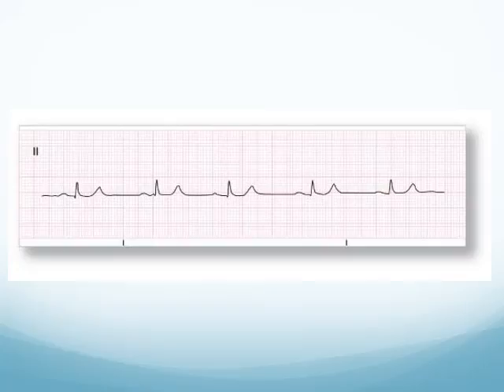What is our rate? It would appear that our rate is about 50 beats a minute. And I'll tell you what I'm doing here. Hopefully we'll have some paper handouts for you by the time you're listening to this. What I'm doing is holding a piece of paper up to the screen with two lines on it from the R to R interval, and then I can hold it up to each complex to show if there's a premature beat.